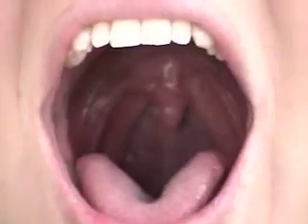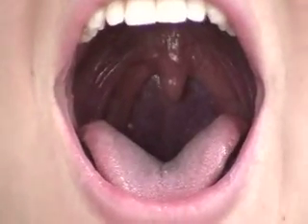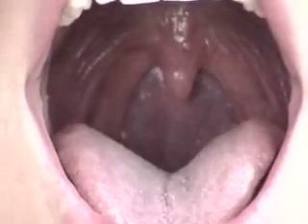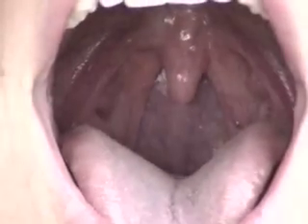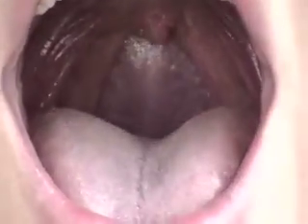Let's take a look at our anatomy. In adults, we talk about the tonsils, but we're really talking about the tonsillar pillars and the uvula. Your job is to go up the first pillar — usually the patient's right side — across the uvula and touch the second pillar on the left before you come out. You can usually do this all in one gag.